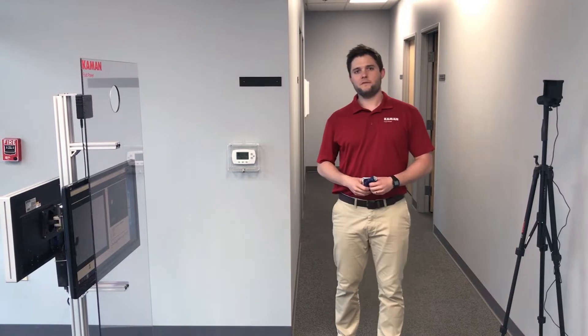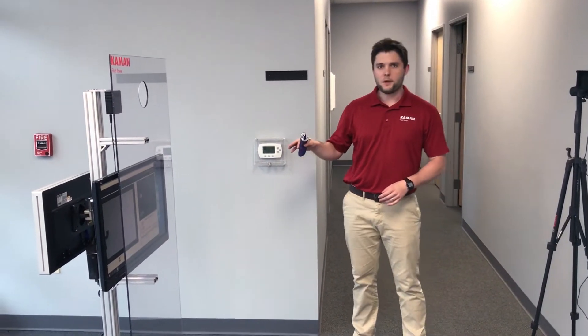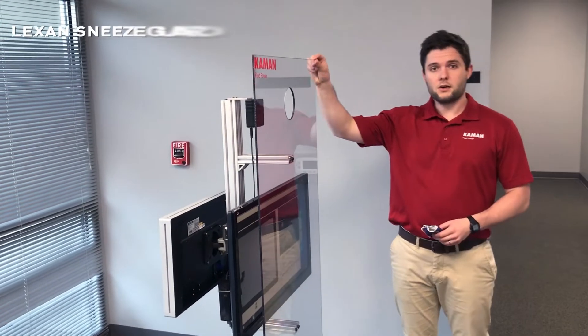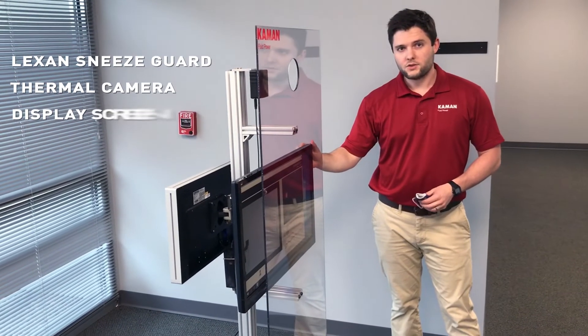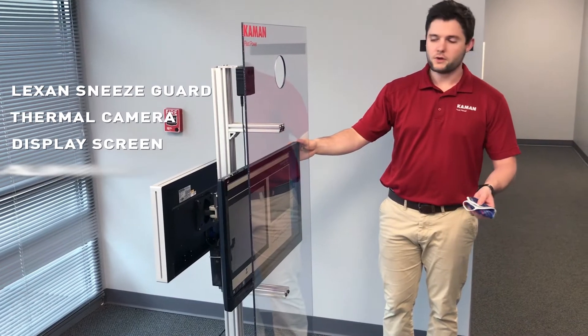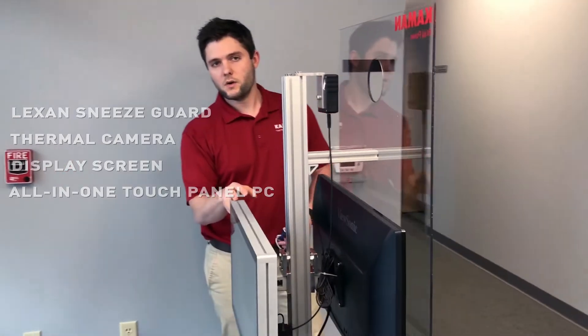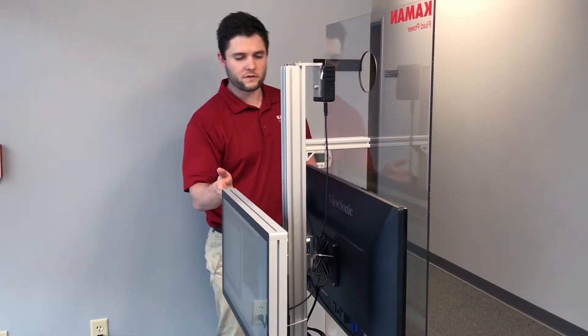Hey, this is Caleb Mabry with Kaman Fluid Power showing you our new skin temperature screening system. What we have here is our standard solution which consists of a Lexan sneeze guard, thermal camera, a display screen that gives instructions to operators, contractors, and employees as they're coming through and getting screened, and an all-in-one touch panel PC running Windows 10 OS in case you have any applications or programs that need to be at your point of entry into your facility.